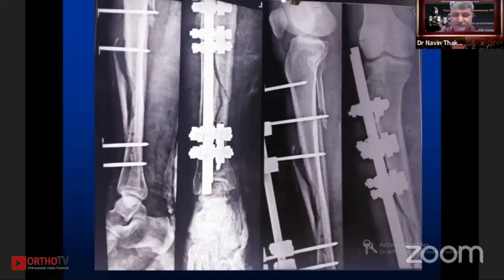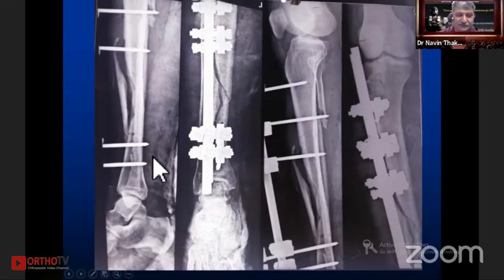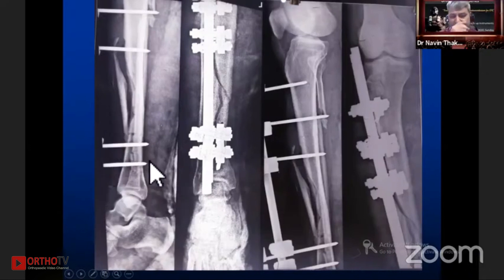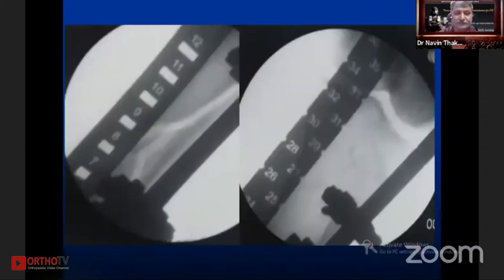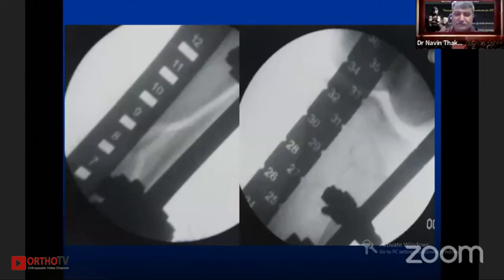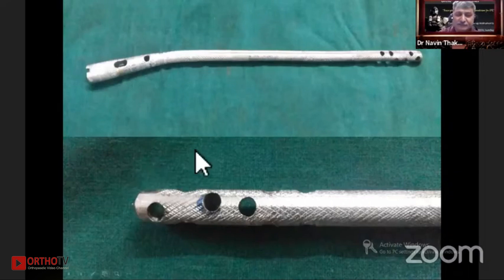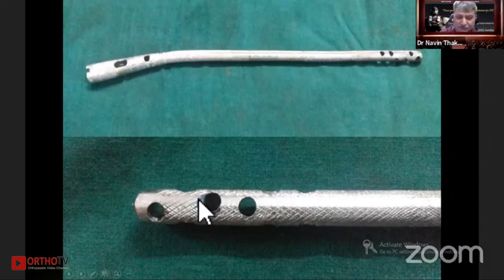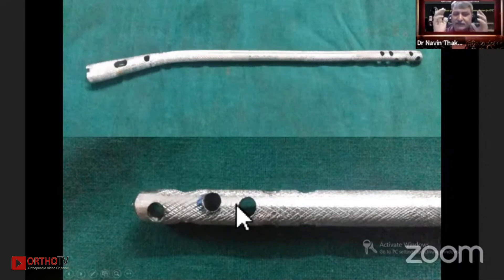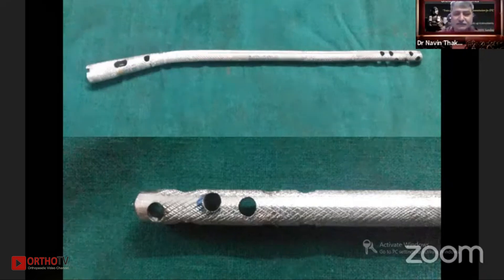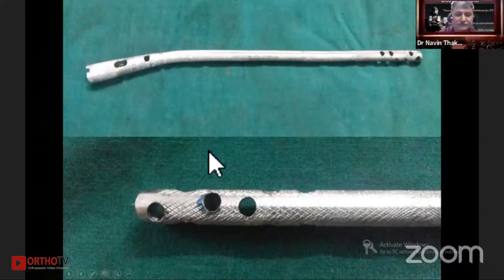These got infected, so the whole canal is infected. We needed to pass an antibiotic-coated nail, but the metaphyseal region is very small, so we need more holes here. We measured the length of the nail, customized it for that particular patient, and then made a nail where a criss-cross pattern has been done on the nail surface, and special holes are made — four holes — to get interlocking for rotational stability in the distal part.